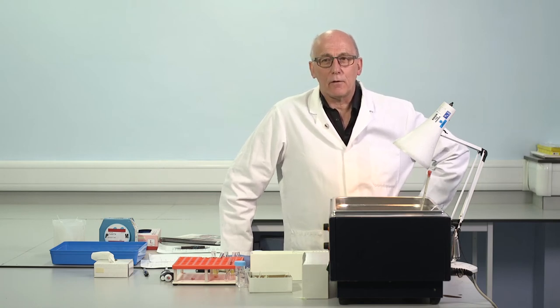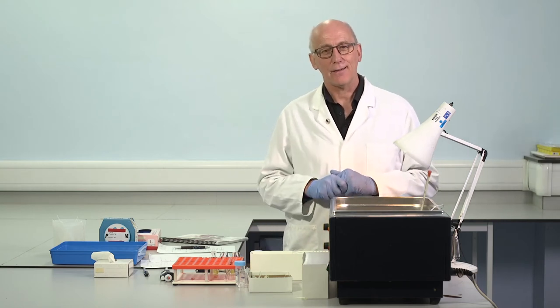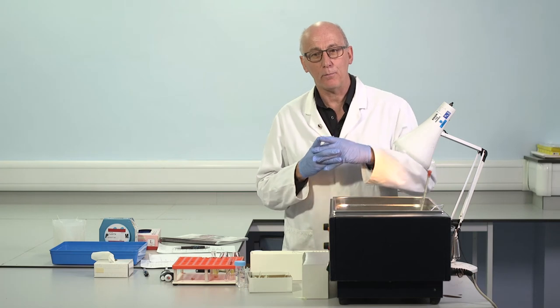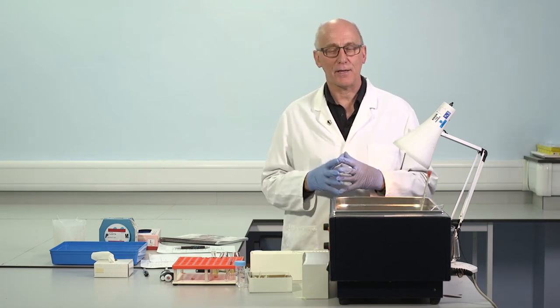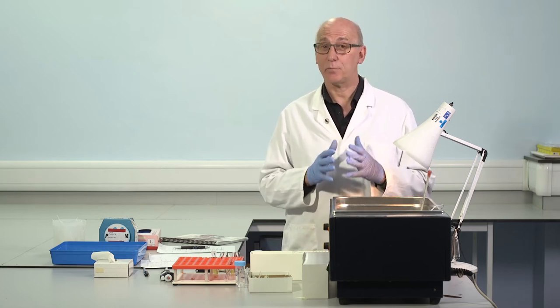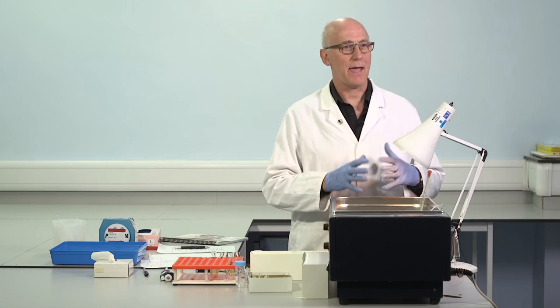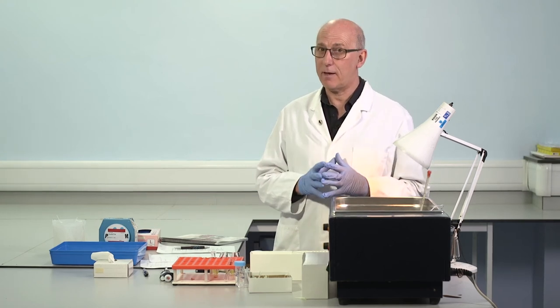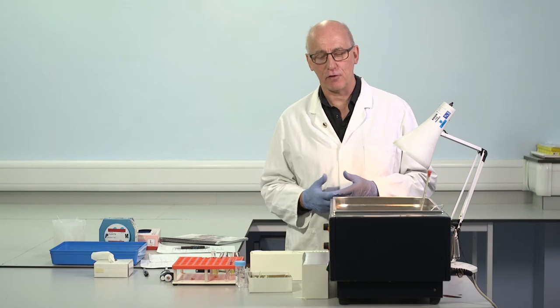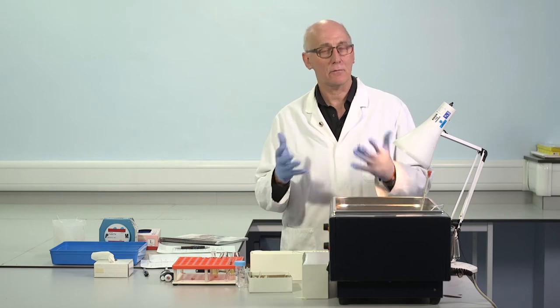And so I think a very useful way to help differentiate between these two and again to shape what we do next is to make a mixture of patient sample with pooled normal plasma. Pooled normal plasma, by definition, will contain all the clotting factors. It must be carefully prepared in such a way that we're very confident it does not contain anything that might have inhibitors. So we have to think carefully about the source material for this. Pooled normal plasma will contain normal concentrations of all the clotting factors, the contact factors, also factor 8, factor 9, 10, all the clotting factors.